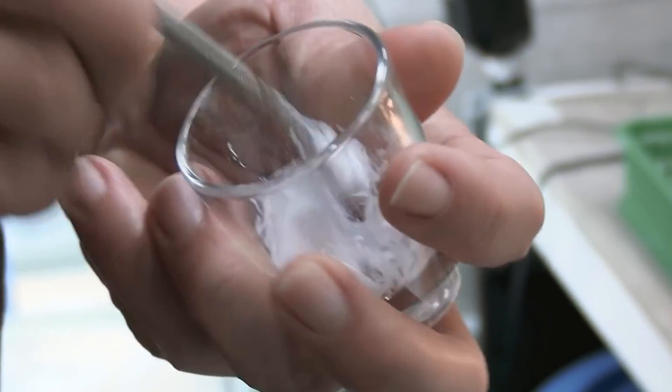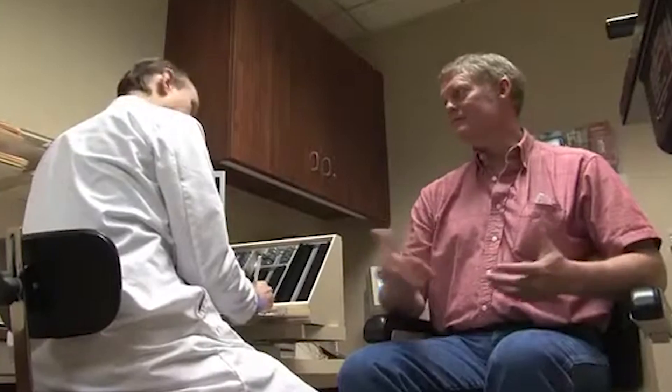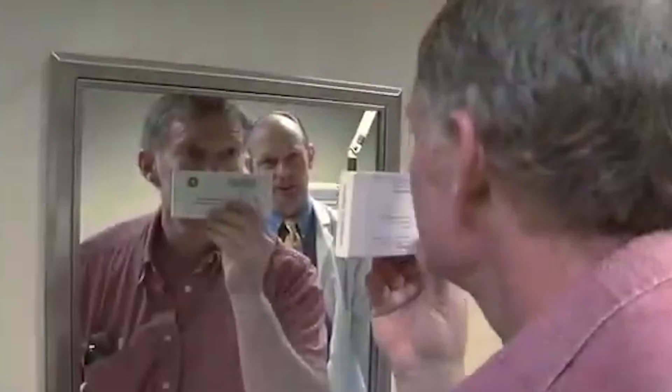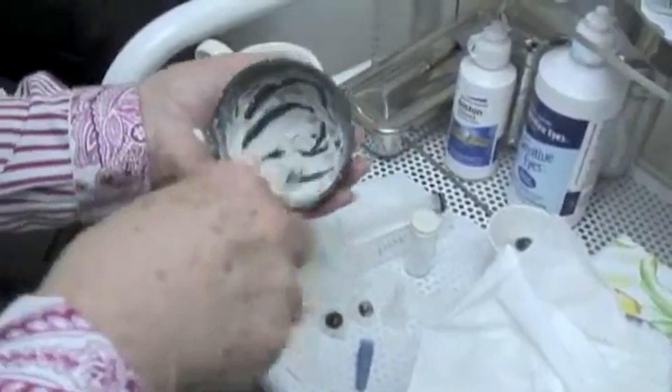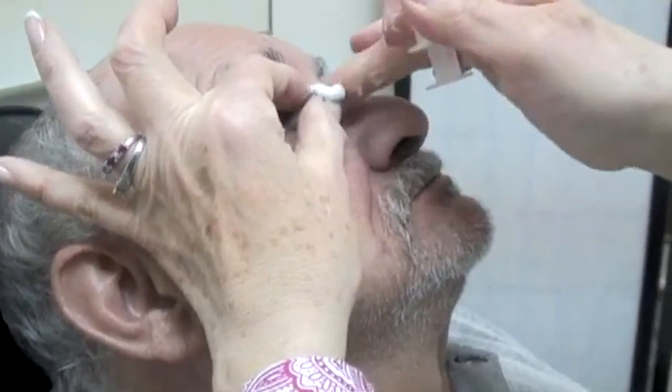Today, most artificial eyes are made of acrylic, marking a shift from traditional materials. The process begins with an initial consultation with an ocularist, who specializes in fabricating ocular prostheses, during which the patient's needs and preferences are discussed. The ocularist then takes an impression of the eye socket using alginate, a white powder made from seaweed mixed with water to form a cream, also used by dentists to make impressions of gums. This impression captures the exact size, shape, and contours of the eye socket, providing a blueprint for creating the artificial eye.